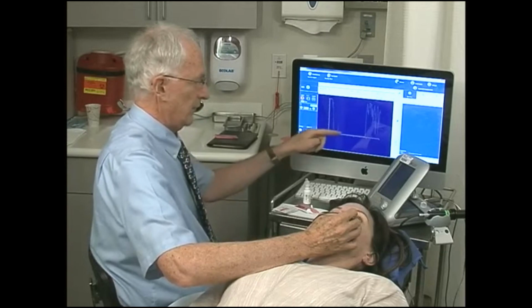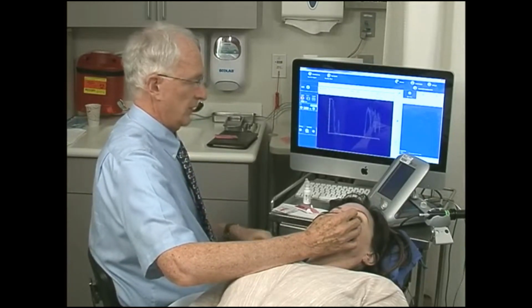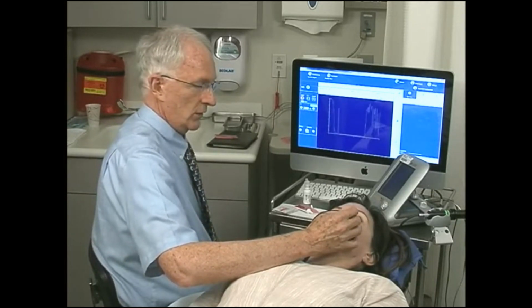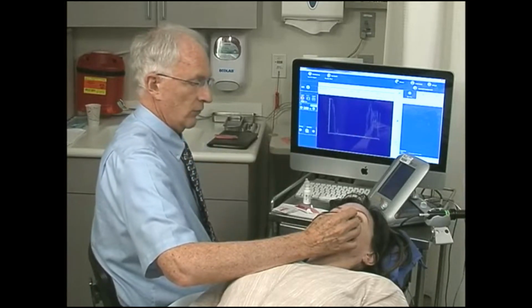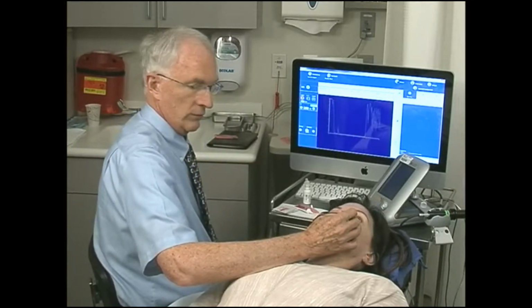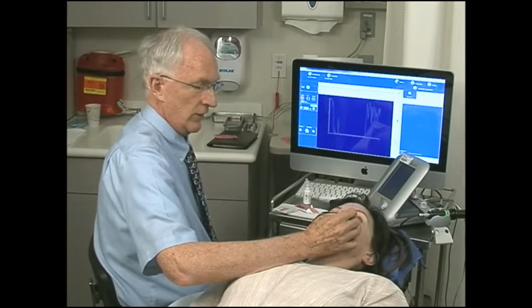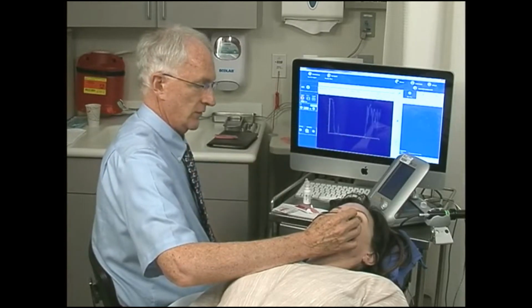And correspondingly, the A scan display is a flat line. Once I get into high reflective tissue on the B scan, which is contrasted to the A scan, I see high reflectivity from the orbital structure. The orbit has many interfaces in it. It has muscles and fat, septa, and these give high reflectivity, so that contrast on the A scan.